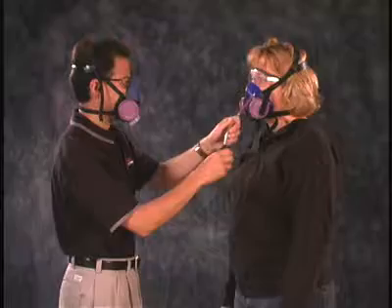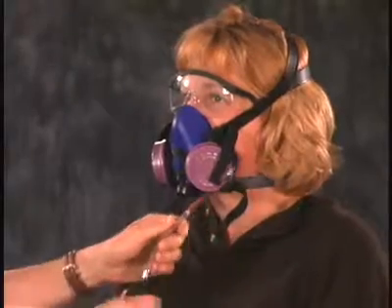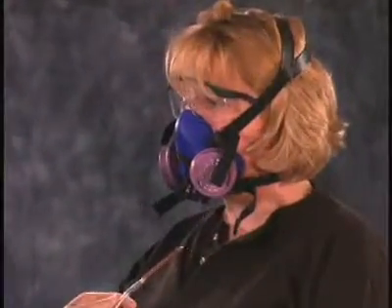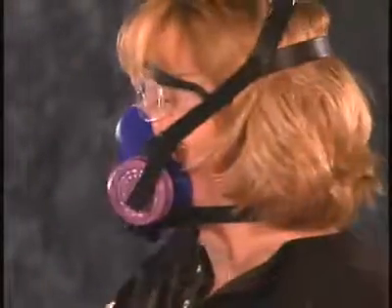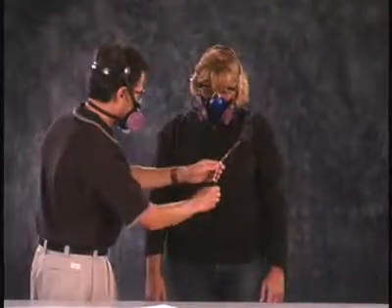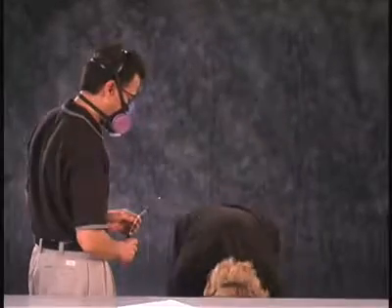Direct a stream of smoke from the tube beginning at least 12 inches from the facepiece, gradually making 2 passes within 6 inches around the perimeter of the mask. Be careful not to direct the stream of smoke directly into the P100 filter. Direct the subject to perform the 7 exercises shown earlier and described in Section 1A.14 while challenging the respirator with the smoke at a distance of 6 inches.